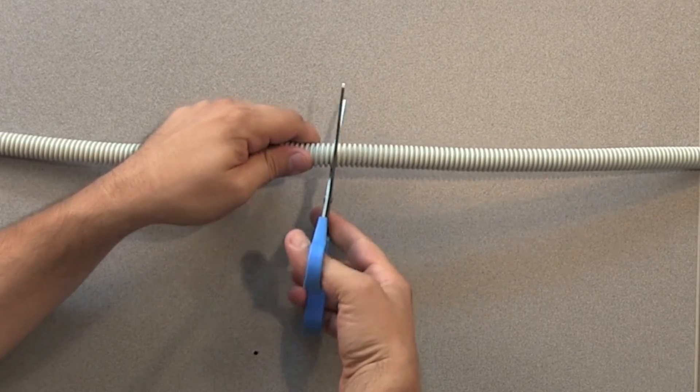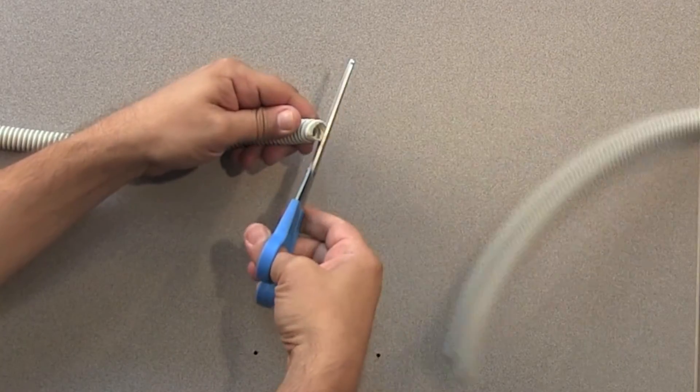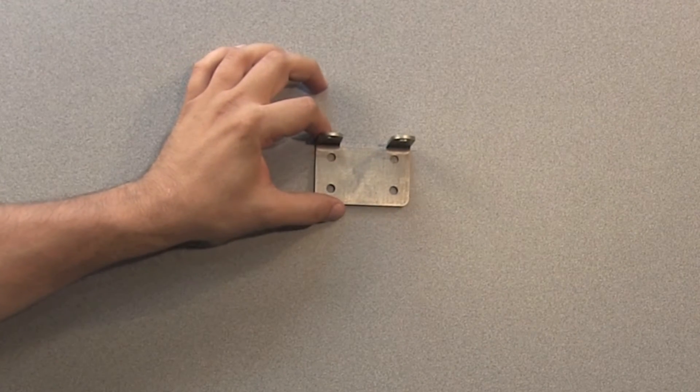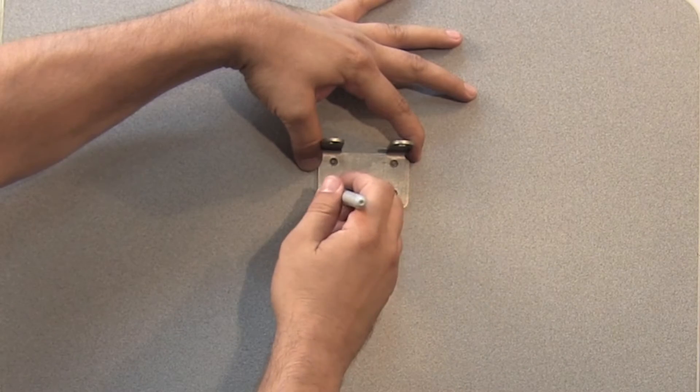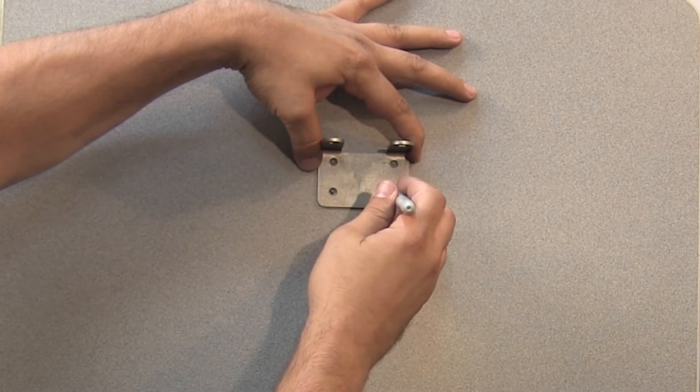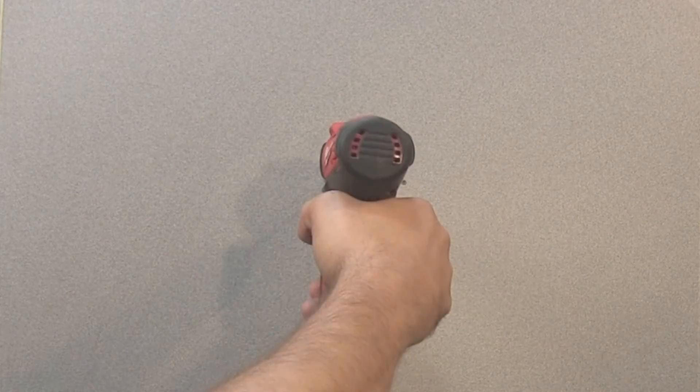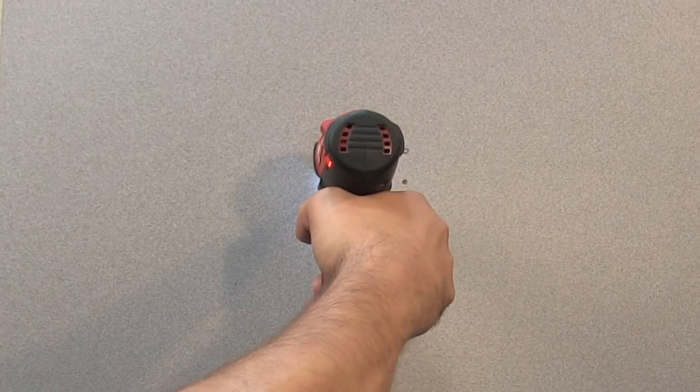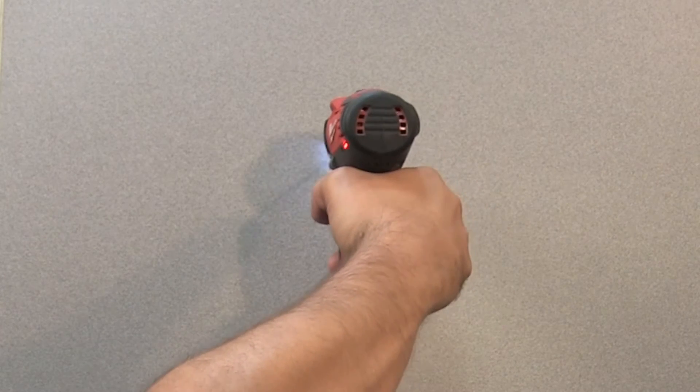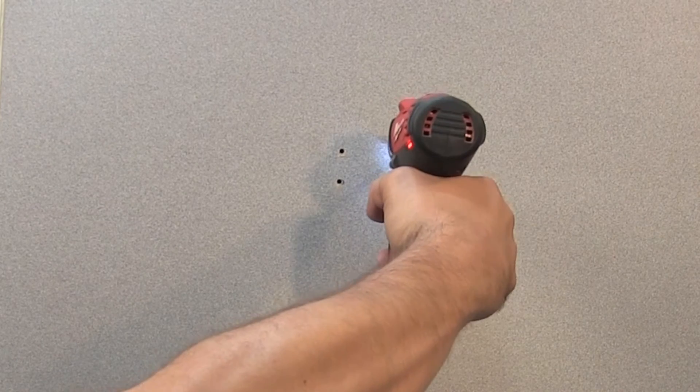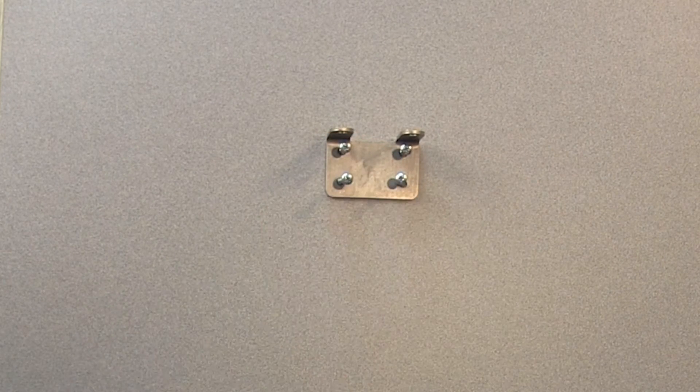We'll split the flexible vacuum tubing where we want to mount the manifold bracket. We'll grab the manifold mounting bracket and use it to mark the wall with a bracket screw hole pattern. We'll then drill where we mark to make it easier to screw in the bracket attachment screws. It's now time to attach the manifold mounting bracket to the wall.